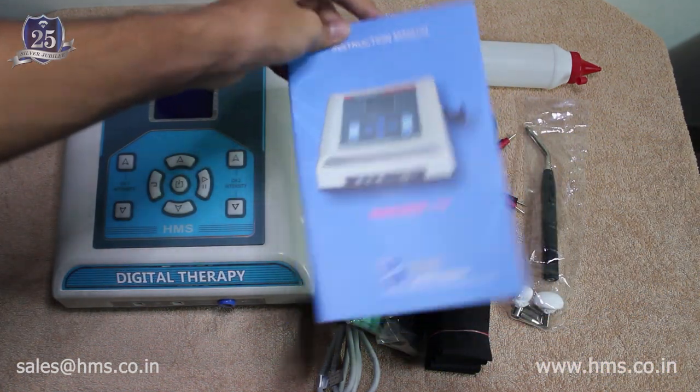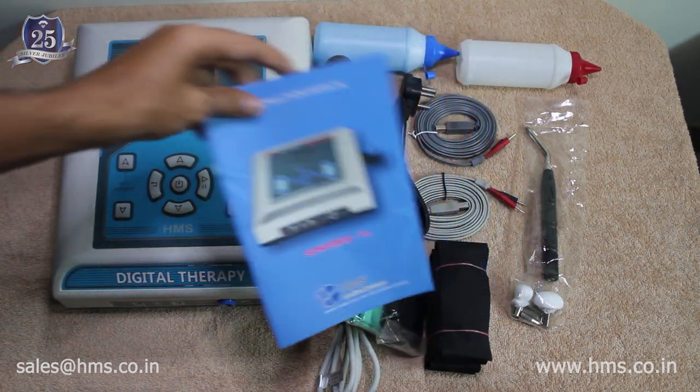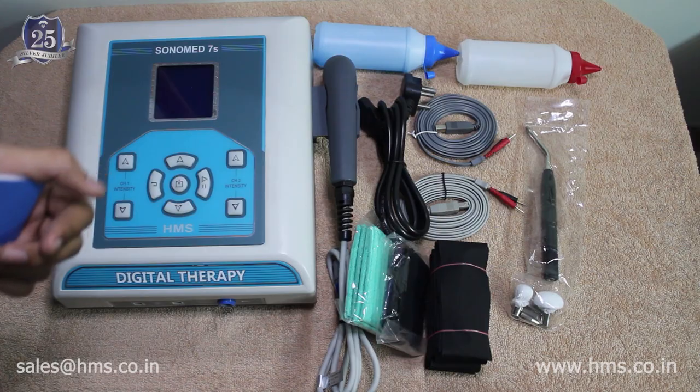We also provide a user manual to clear all doubts regarding the machine's functionalities. These are the AX series accessories provided with the machine out of the box. Now we will get to the function of the machine and how it operates.